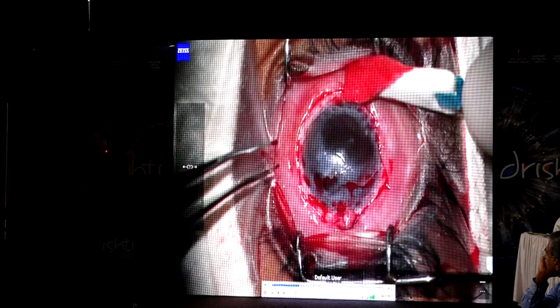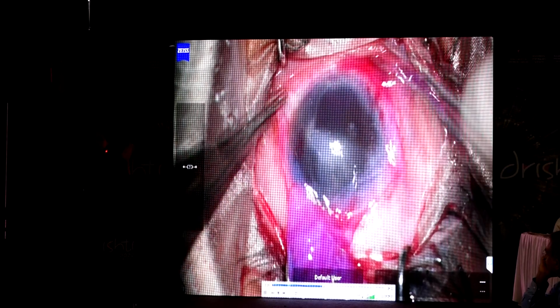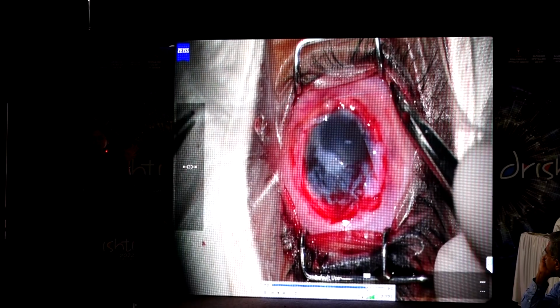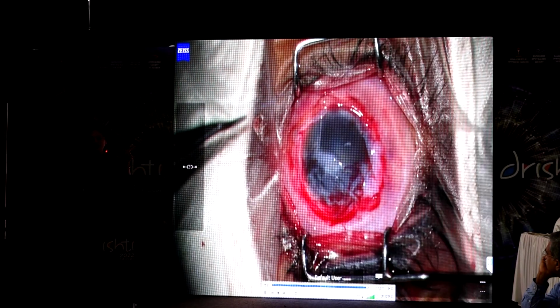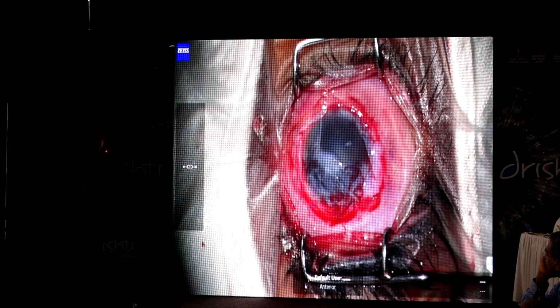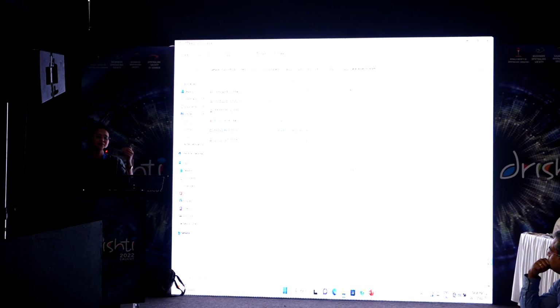And then if I'm doing a SLET, I carry on and complete the SLET on this patient. So here you see a 360 degrees peritomy. The surface is well controlled with cautery here. The amniotic membrane is placed on the surface and sutured onto all the edges of the conjunctiva as I described in the acute chemical injury management as well. Then put in glue and fixate and allow the surface to heal with adequate antifibrotic therapy here. So this also helps you to optimize the ocular surface before you take the surface on for a simple limbal epithelial stem cell transplantation if it's a uniocular case here.